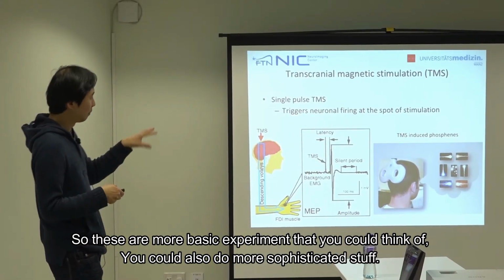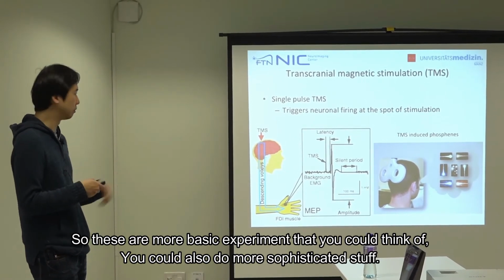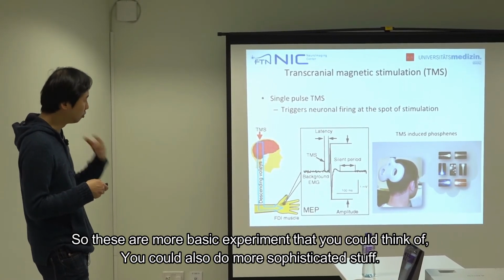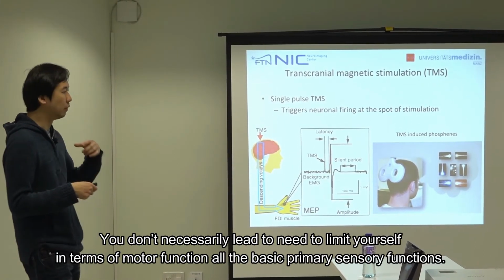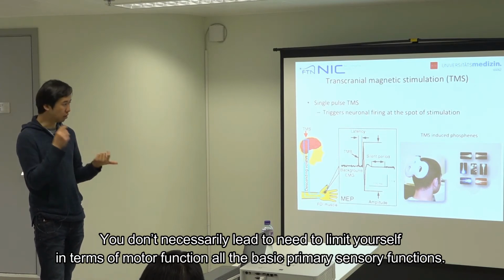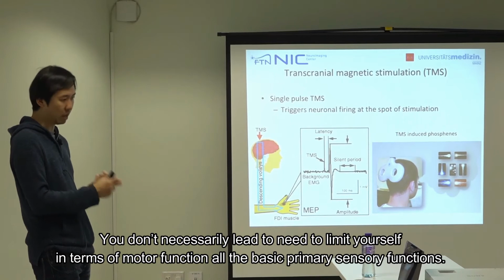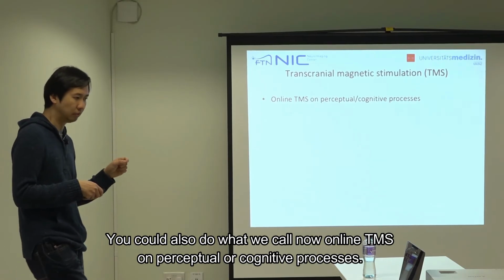So these are more basic experiments that you could think of. You could also do more sophisticated stuff. You don't necessarily need to limit yourselves to the motor function or the basic primary sensory functions. You could also do what we call online TMS on perceptual or cognitive processes.